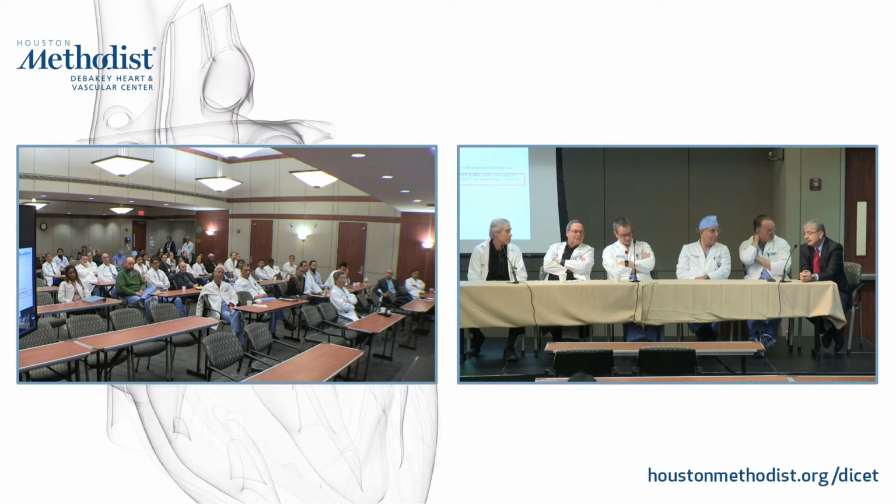but you don't see anything underlying, meaning at times the pannus is so strategic in affecting the hinges of the valve that you may not see anything. You see a valve that is stuck or poorly mobile, and we've shown that in our previous investigation. So if you don't see anything, most likely it's pannus, right? And if you see a thrombus, usually it's large. I mean, these valves are rather small, but the hinges are so tiny that a small impingement on that hinge may actually affect it.